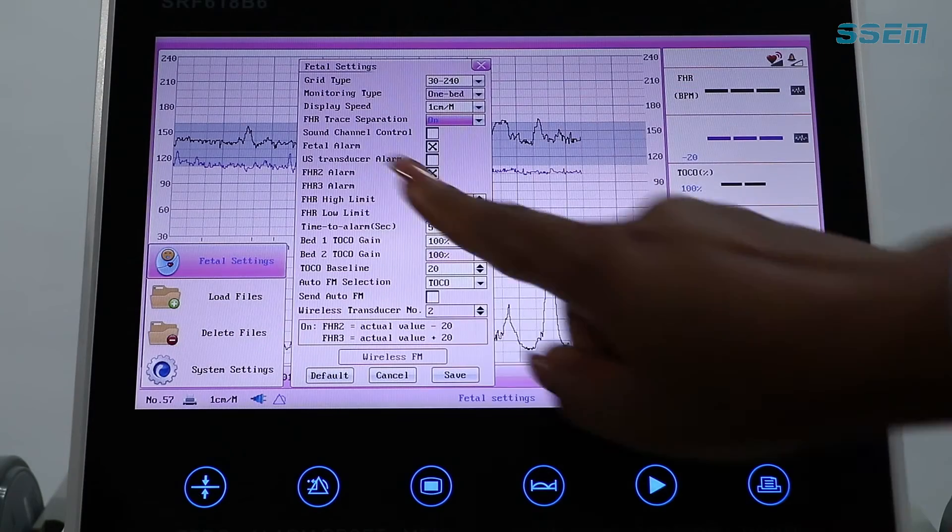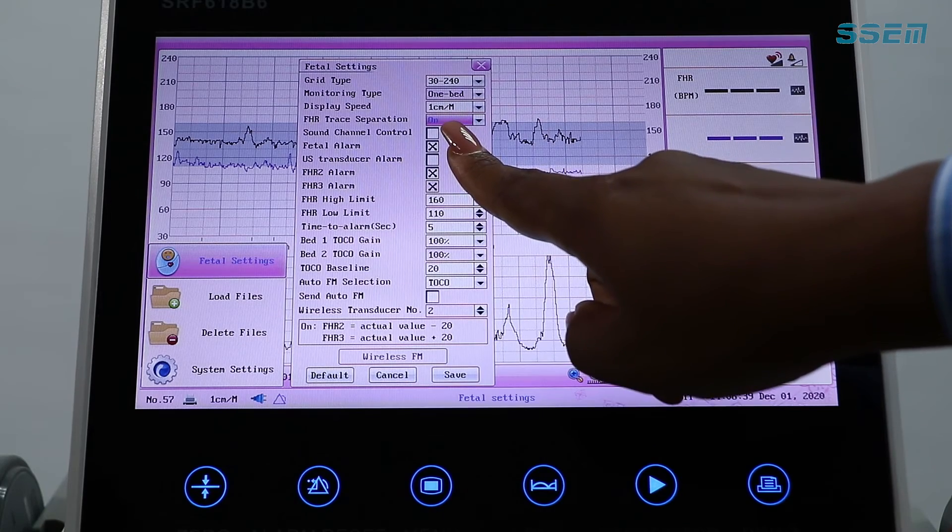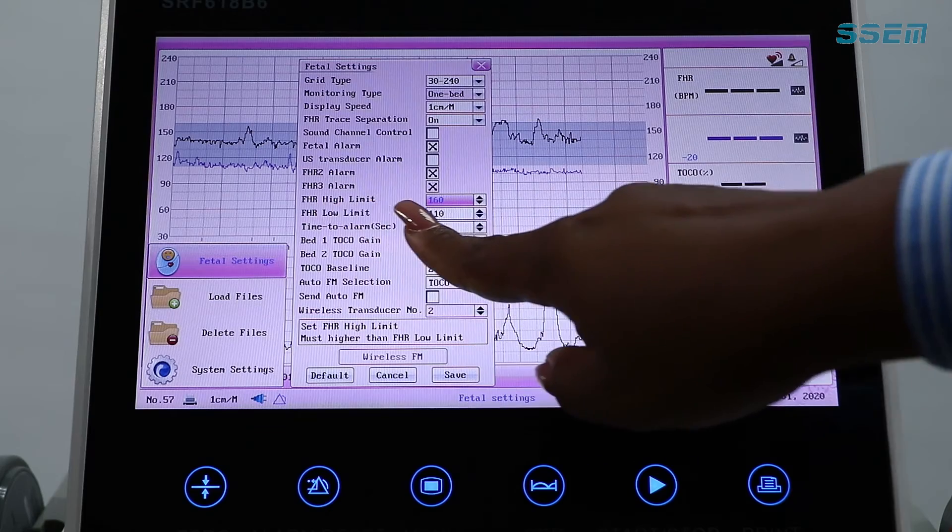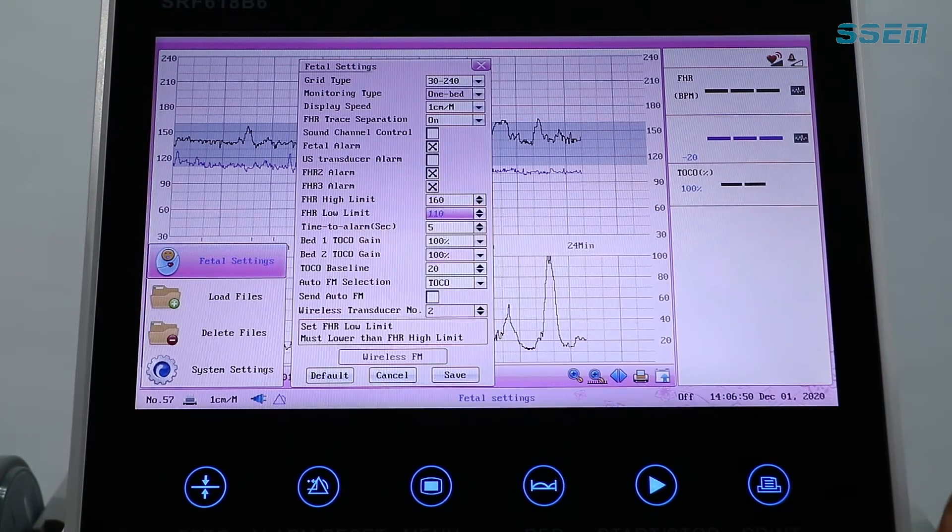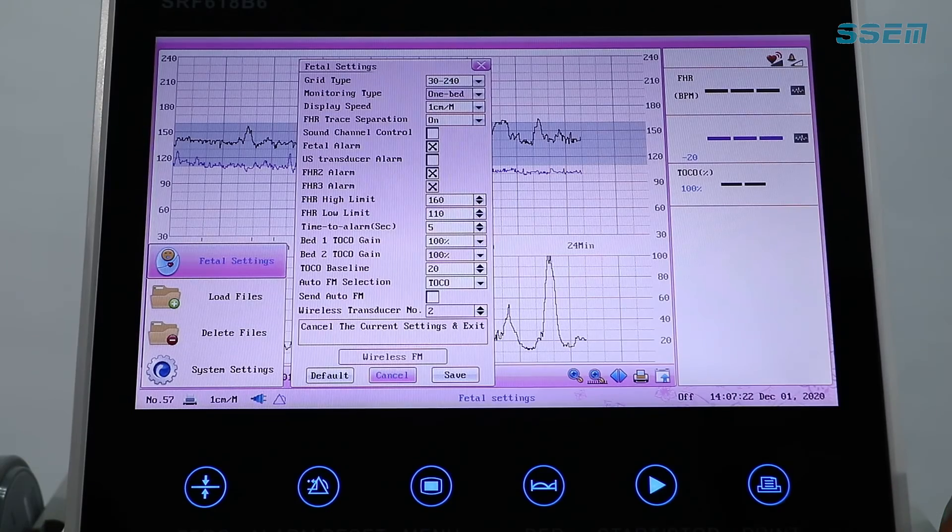Make sure that your fetal separation is on so your FHRs do not overlap. Set your FHR high limits and set your FHR low limits. And then you press save.